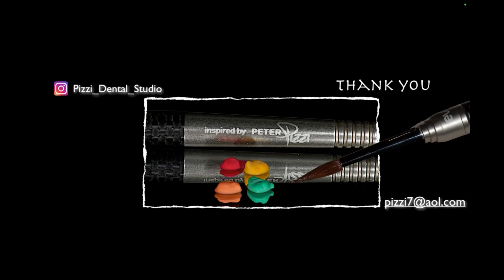And I have lithium disilicate, zirconia, hybrid materials, monolithic this, layer that, and then I have an implant next to all of that, right? So I have an implant at number 8, I have a veneer on number 9, I have a full coverage that we minimally prep because of the patients, and now all of a sudden with all the materials and all the options and all the new layering materials, it's kind of a nightmare, to be honest.